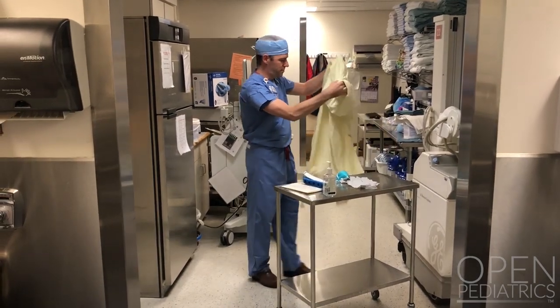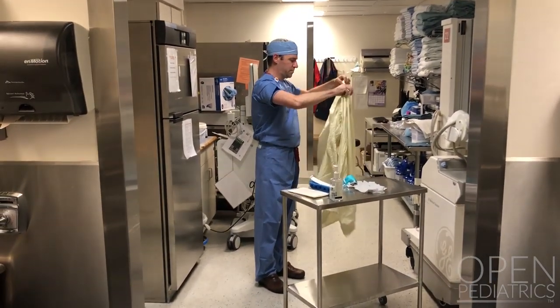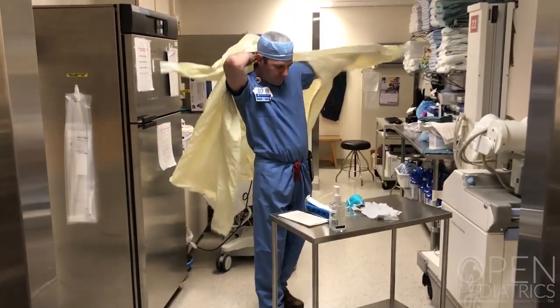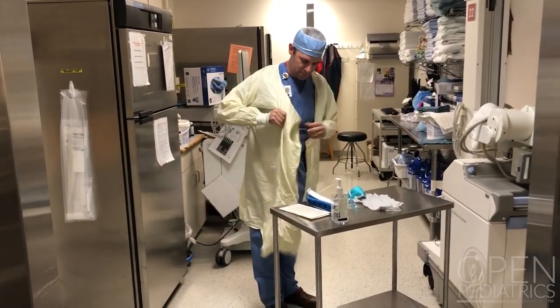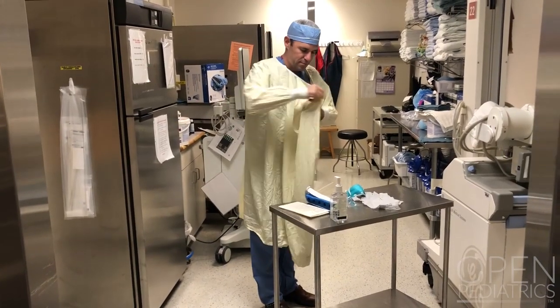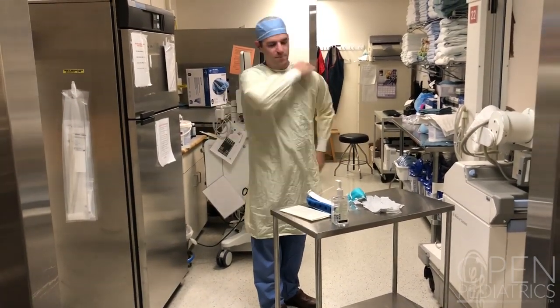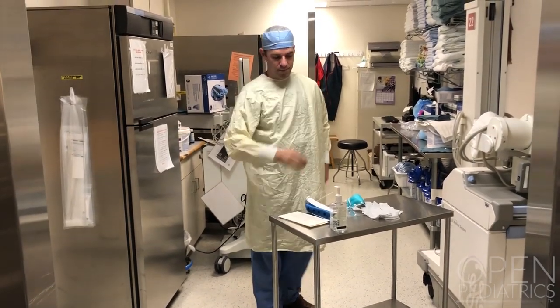Then don your gown. Choose the donning method that fits best for you — you may have to practice a number of times to find the best fit. Be sure that the shoulder is in a good position so it doesn't slip off.